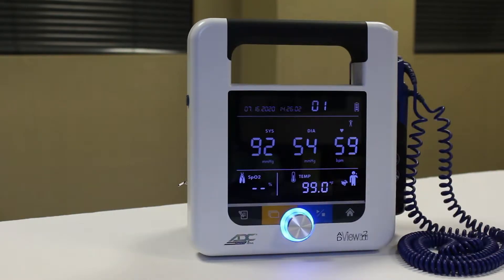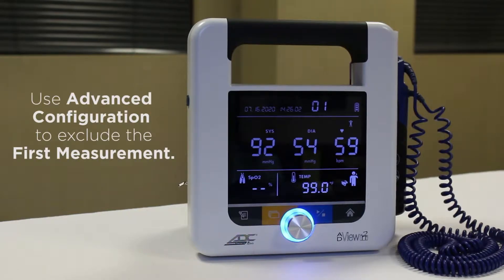By default, all measurements taken during an average mode reading will be included in the average. But if you prefer, you can program your AdVue 2 to exclude the first measurement from the calculation.